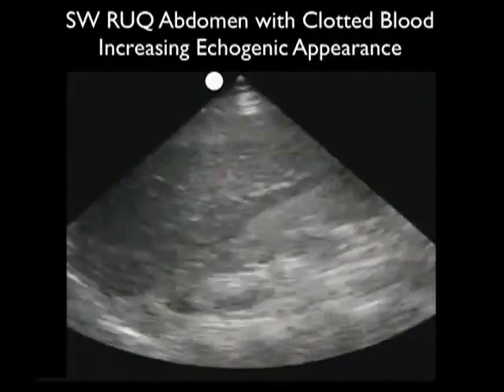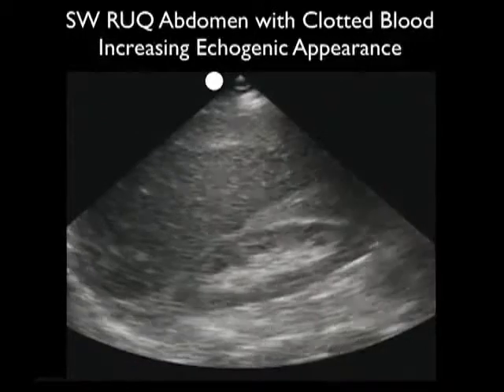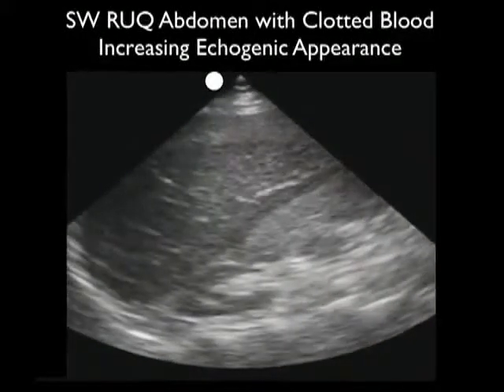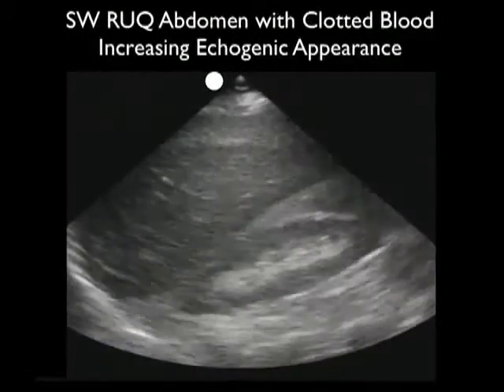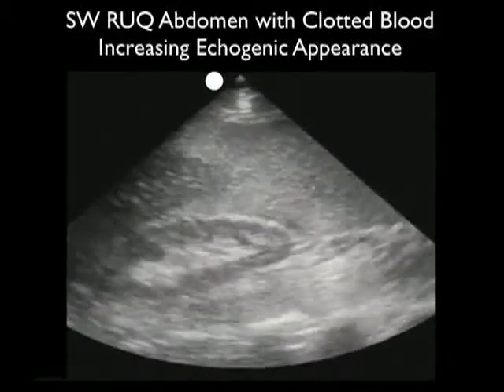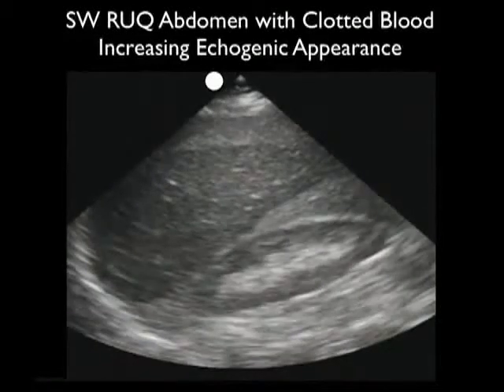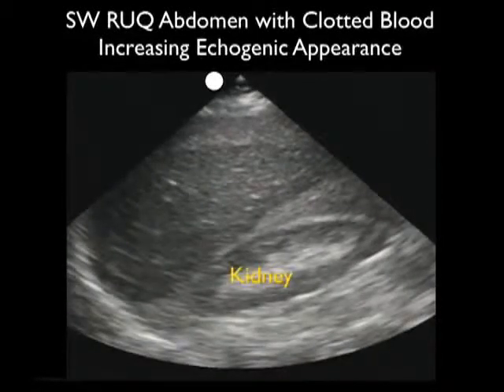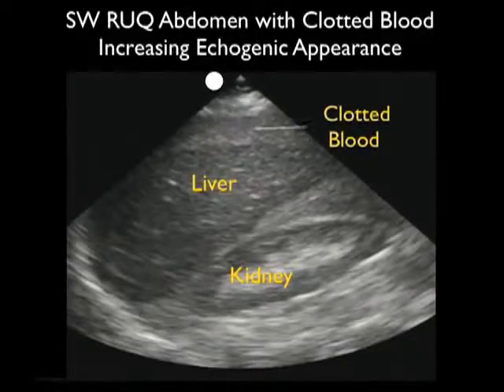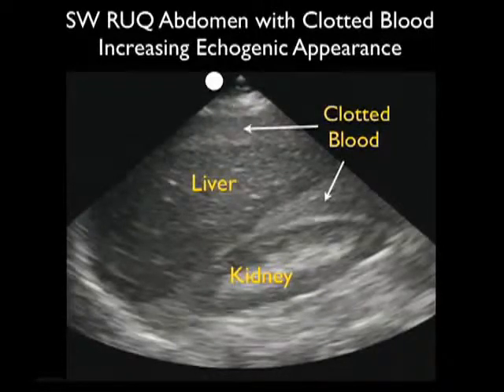In this video clip, a patient was stabbed and had a significant downtime before being brought to the emergency department. As we look at the hepatorenal interface, we see a large amount of clotted blood made up by that echogenic or lighter appearance. Notice that the large amount of blood extends into the right pericolic gutter as we scan inferiorly. Here we can see the liver, the kidney, and the clotted blood — that more echogenic or lighter blood — in Morrison's pouch.